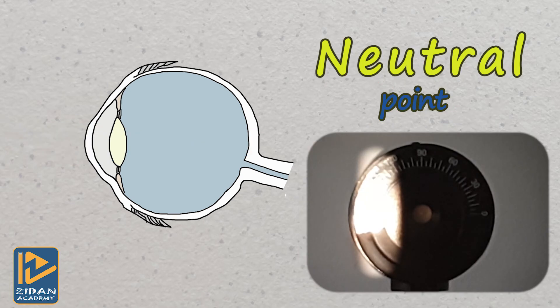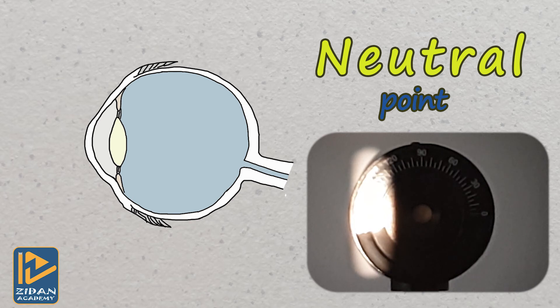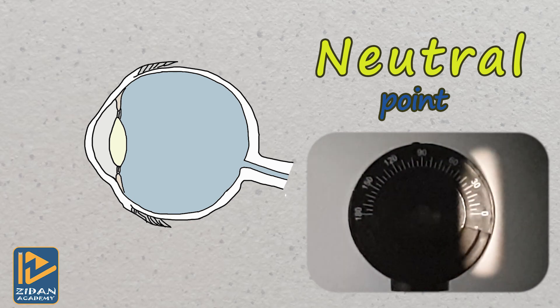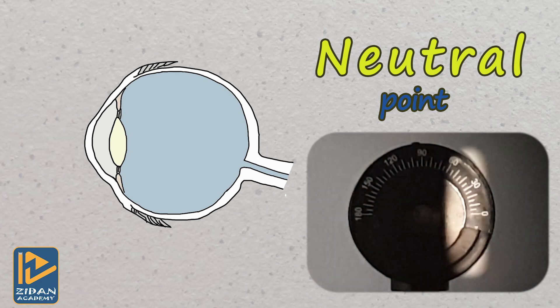And finally, let's move to the neutralization state. Here is our video again. The pupil is filled with light and there is no definite with or against movement that could be seen.